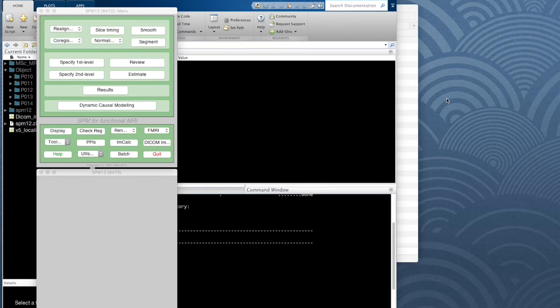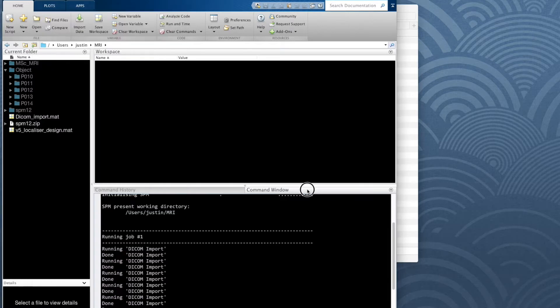SPM has now finished importing those DICOM images and converting them to NIfTI format. Sometimes it's difficult to tell if SPM has finished because the progress window just goes blank, but if you check the MATLAB command window in the background, it'll tell you when it's done each of the batch elements and when it's done the entire batch job. So you know that's complete.